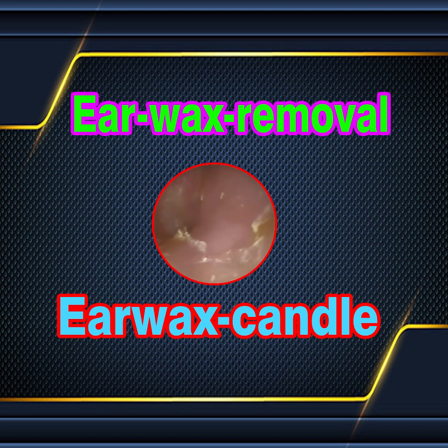Obviously, we don't want to cause any micro abrasions because that's just going to possibly lead to an infection as well. So some crusted skin here. Again, I'm gliding across the surface only. It's really crystallizing. One of the patient's symptoms is itchiness in the ear, and no doubt that's not going to be helpful. Just crusted dead skin. They felt the skin to be very tight in the ear. Which, of course, when you've got this thick layer of crystallized skin around the ear canal, when you move your jaw and your ear moves, you can feel that.